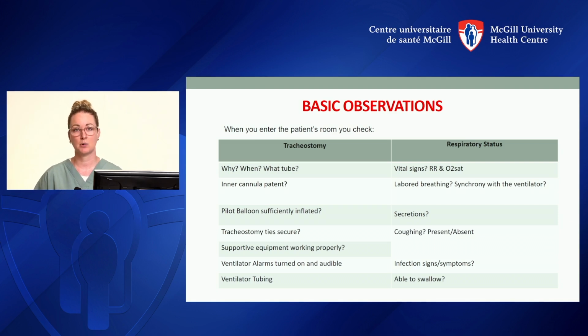If it's a patient who doesn't require mechanical ventilation and arrives on your unit, it's important for you to question if there's still a cuffed tracheostomy tube in place, because it might be time to change it to a cuffless, and that's something you should speak to the physicians about. So again, the pilot balloon, if there is one that's necessary, if this patient is being mechanically ventilated, is it inflated adequately? Again, if they get to your unit and it's there, it's good to question why.